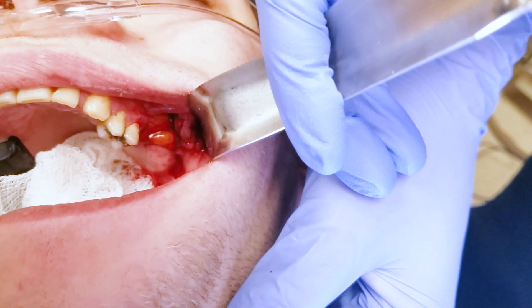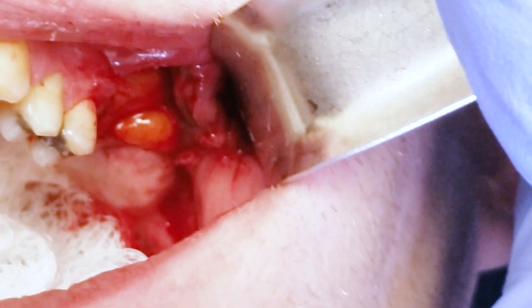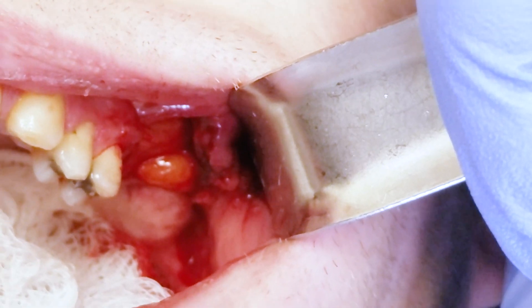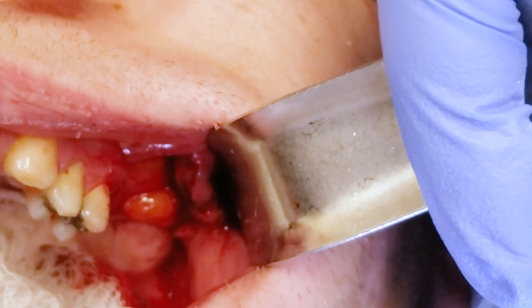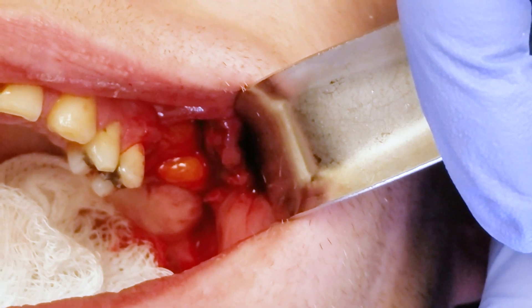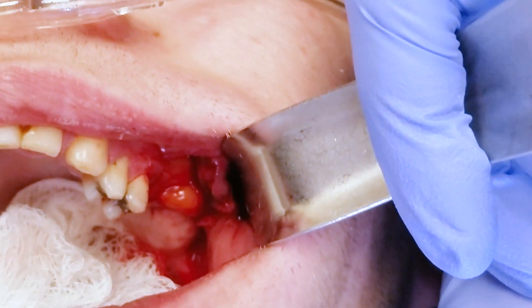After the tooth was removed and the fistula was present, I removed the root tip and then did a buccal fat pad advancement. I teased the buccal fat pad out — you can see it advanced over the fistula. Connective tissue is tucked down first into the fistula, then the fat pad is advanced over and sutured in place. Then the cheek is loosened up — that's the buccal sliding flap — and closed over as well. So there are essentially three layers closing this off.